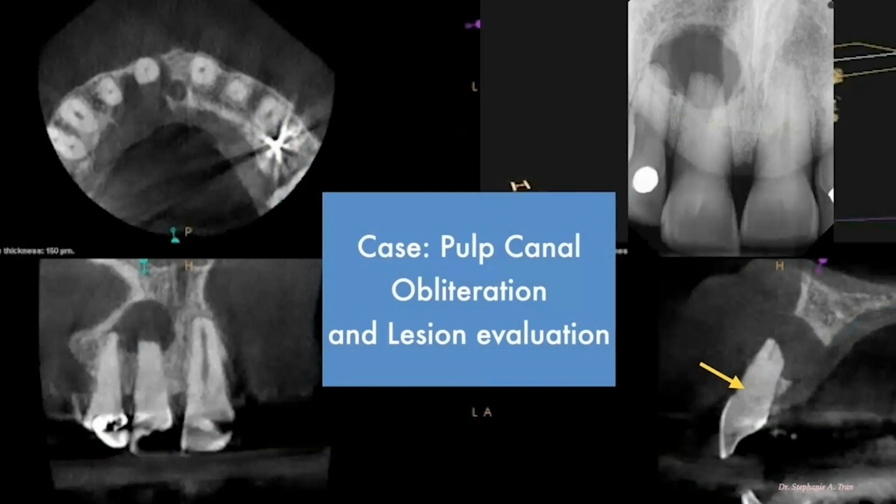Upon scanning, the CBCT reveals that you can't even see the canal all the way up until the apical few millimeters. That means it is so calcified, the canal is not even visible all the way down the tooth until the apical third. When it's that calcified, unfortunately, even with certain guides, it's very, very difficult to treat the canal system because you can't actually get into the canal until like 20 millimeters down the tooth, and that's too difficult.